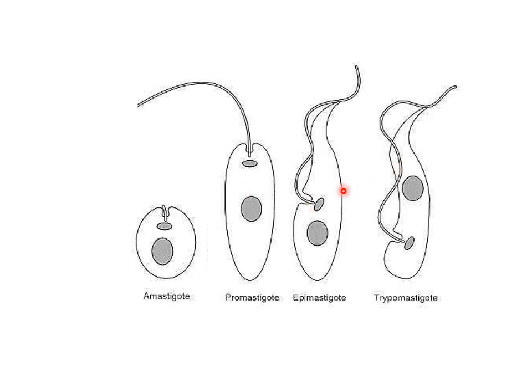What differs in this stage from promastigotes or trypomastigotes is that the flagellum is usually located at half of the size of the body, so it occupies half the length of the stage. Again, the kinetoplast is also located at the anterior side of the stage, and it is anterior if we compare it to the nucleus.